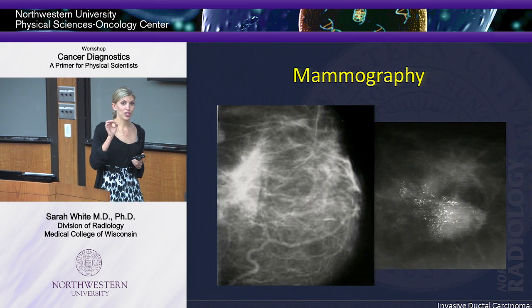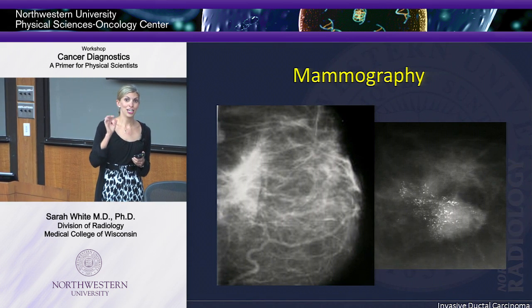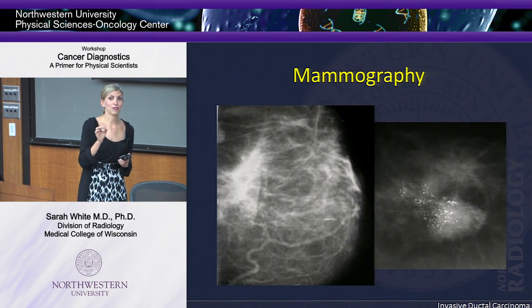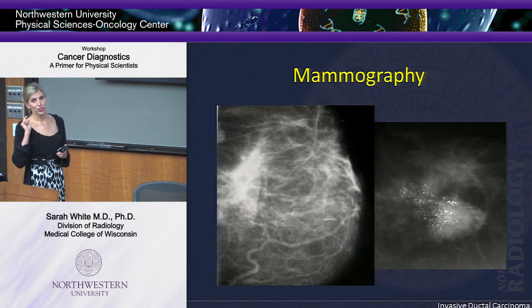They're dots. I'm telling you, they're dots in an X-ray, and you have to be able to see a dot on an X-ray, but it's different than the surrounding tissue. So that one dot can be enough for a mammographer to say, you know what, this doesn't look right. You need to come in and get a biopsy.